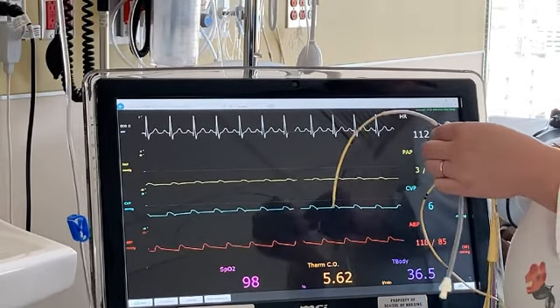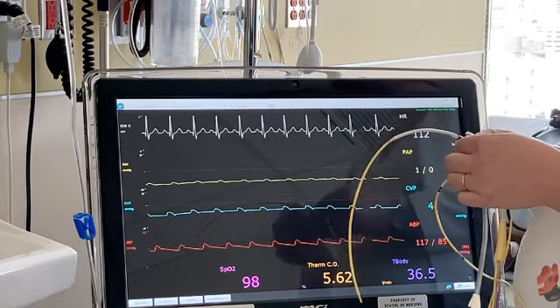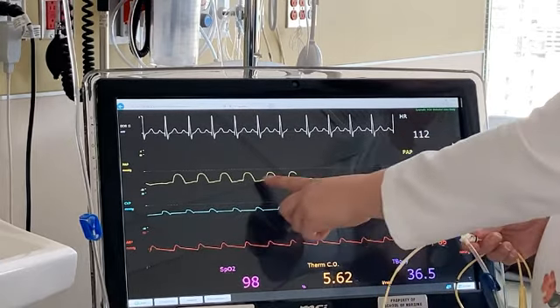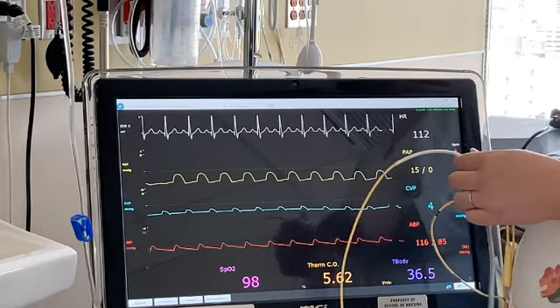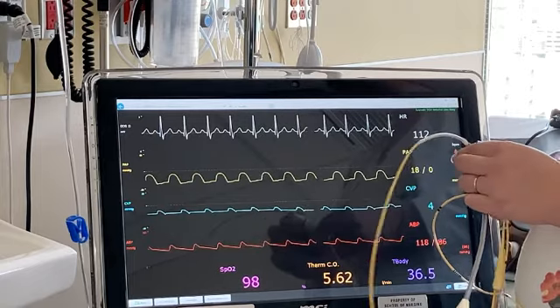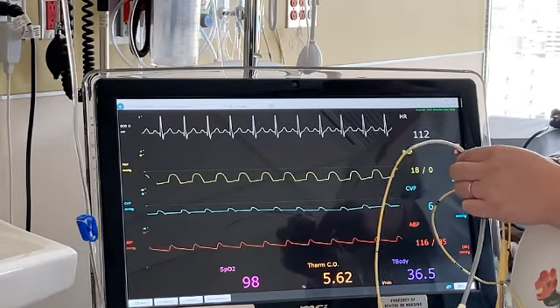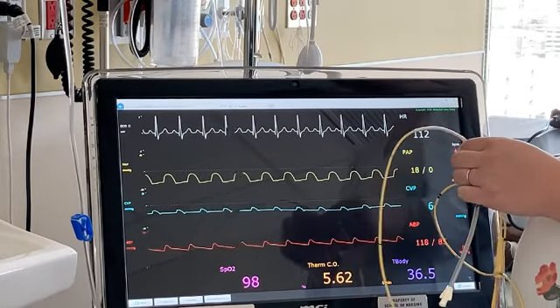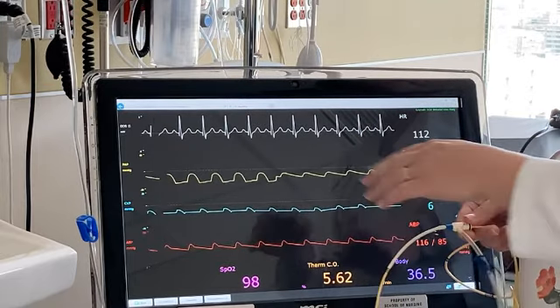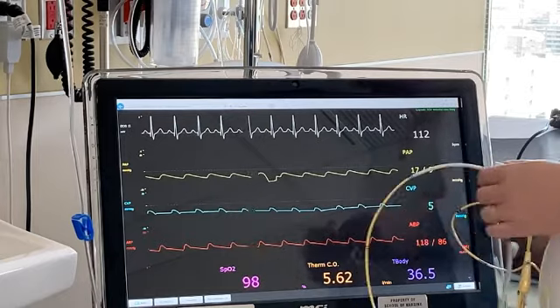So that's why they look essentially identical. And then if we continue pushing and threading through, we would end up in the right ventricle. And so now we know here that we're in the right ventricle. This is actually a dangerous place to be because it could cause a lot of dysrhythmias. So we want to move quickly through that one, through the pulmonic valve and into the pulmonary artery. And now we would end up with our pulmonary artery pressure.